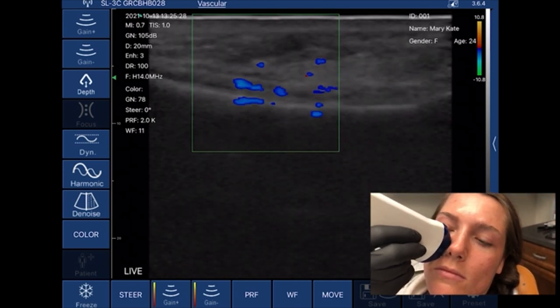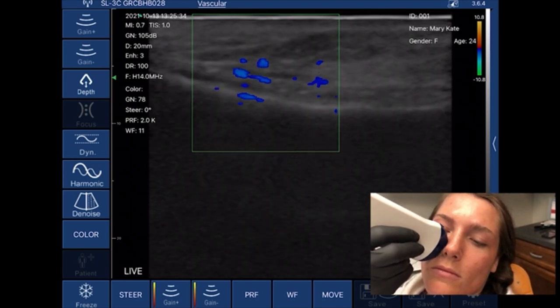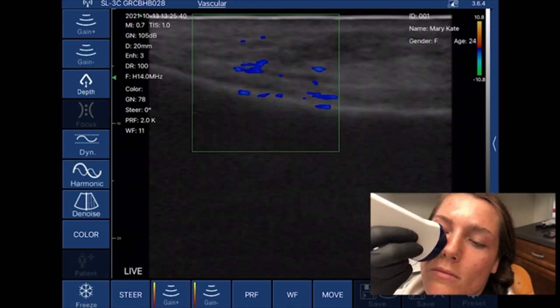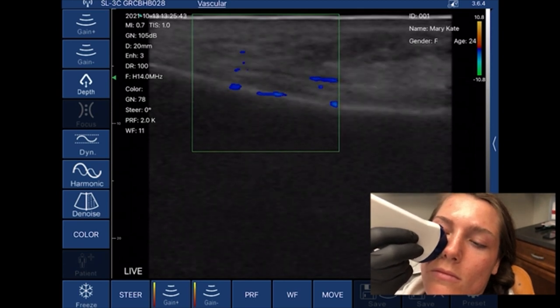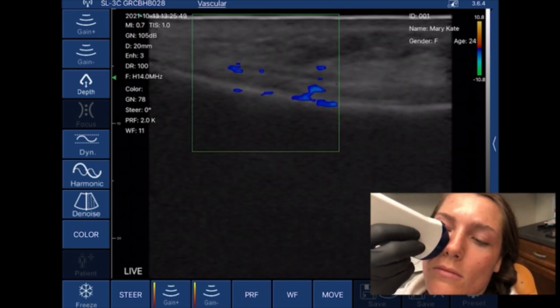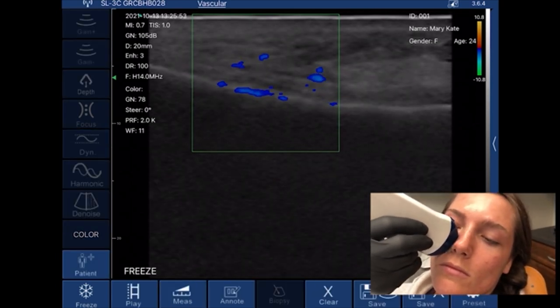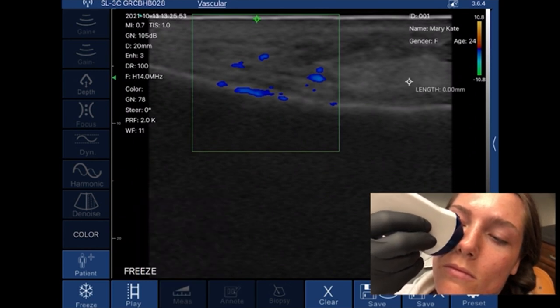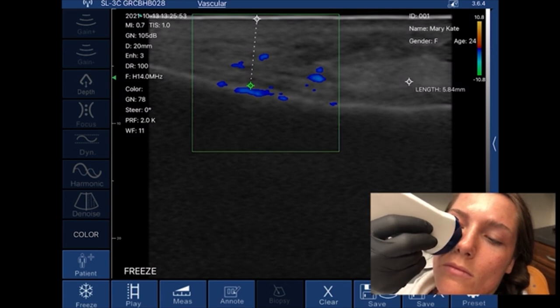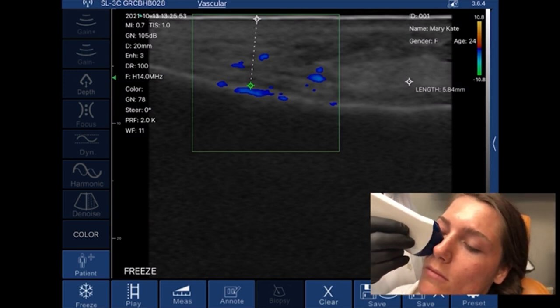Parts of that facial artery are on the bone, and parts of it are going to be above as it courses through the tissue. That's the important part about using ultrasound — now I know exactly what we're dealing with, because it's not always that you find this facial artery on the bone. Let me go ahead and freeze this screen and measure where that facial artery is from the top of the screen down. It's right against the bone, and that is about 5.84 millimeters deep. That's the power of ultrasound, and especially the power of the WAVE-FE.